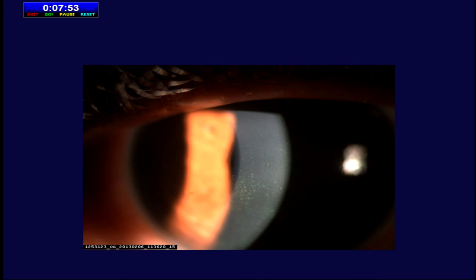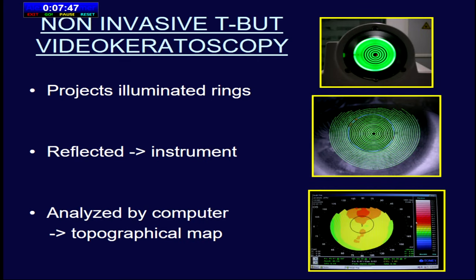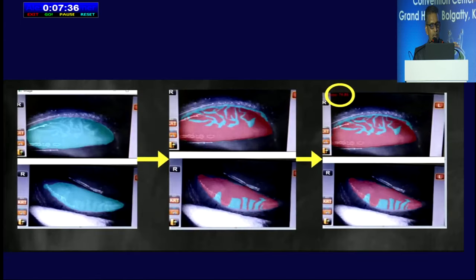It's important for retinal surgery as well as cataract surgery. Then if you have some pathology, you go for other investigations depending on tear breakup time, non-invasive tear breakup time, meibography and stuff like that. And nowadays, there is a lot of talk about various devices which look at the meibomian secretions. Being a hospital which does not have a lot of resources to invest in huge instruments like these, we just use the autorefractometer, and by tying up with a person at IIT, we found that we can actually calculate the area of gland loss very easily with a simple software.